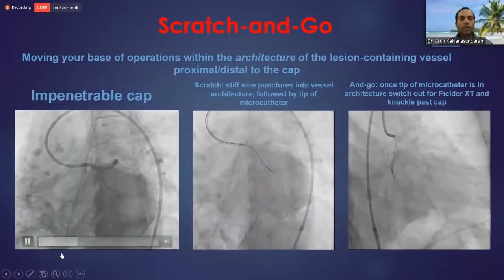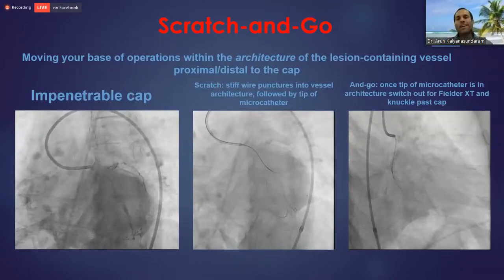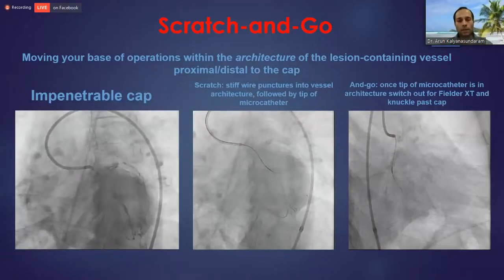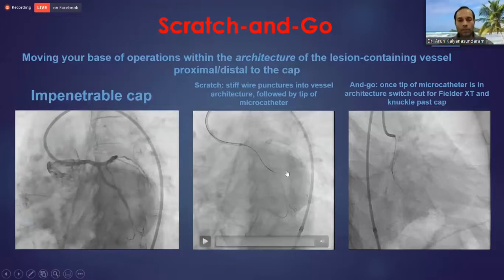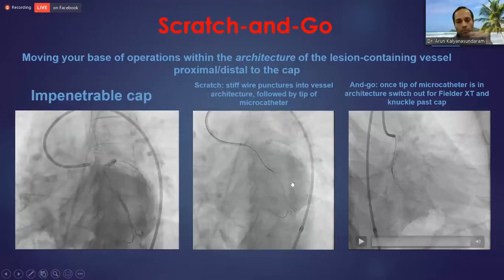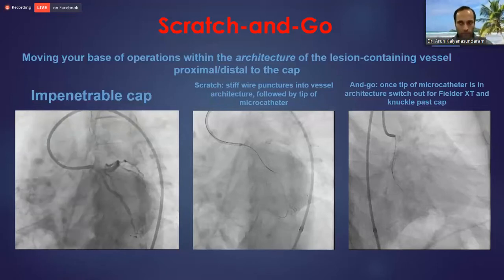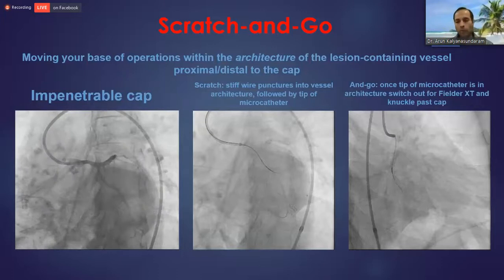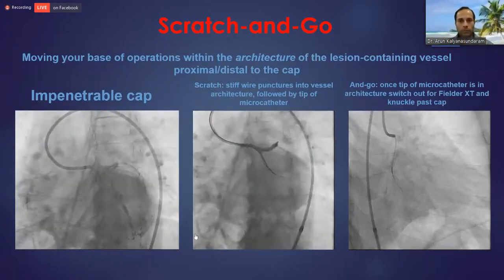Scratch and go, again, if you're really comfortable with microcatheter manipulation and using stiff wires, oftentimes we use the Confianza Pro 12 or the Conquest Pro 12 for this. Use a wire, take a microcatheter, penetrate the proximal cap, very carefully get your microcatheter to the tip of the wire, pull that out, and then oftentimes this is followed by a knuckle. And moving forward.